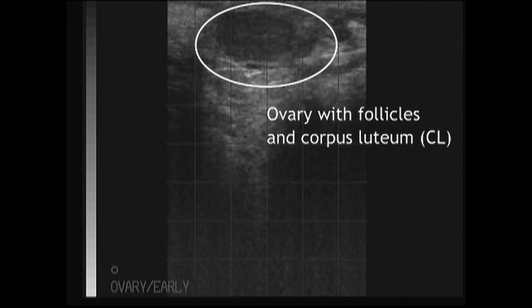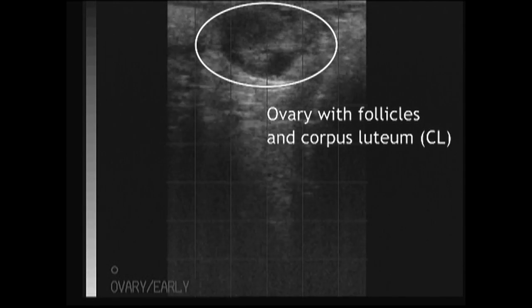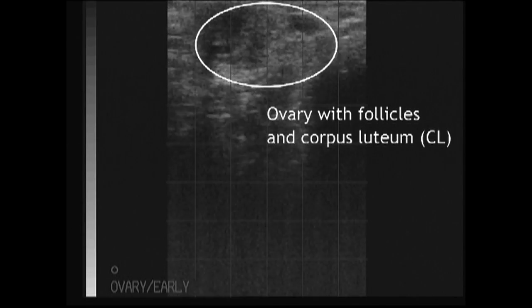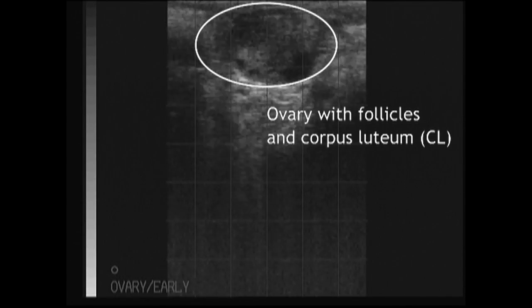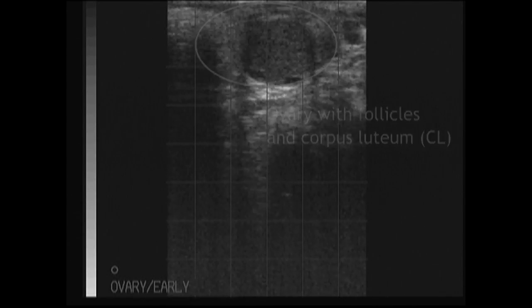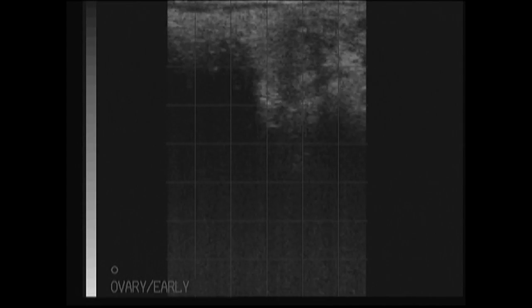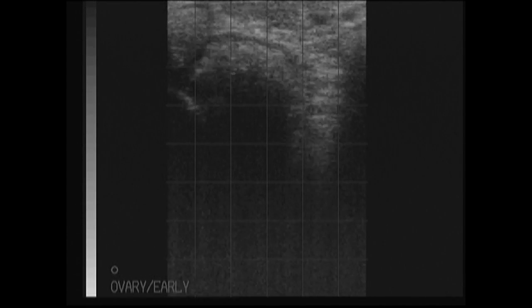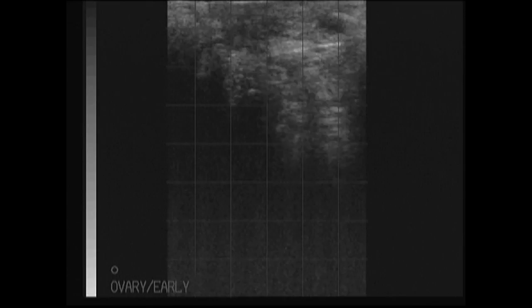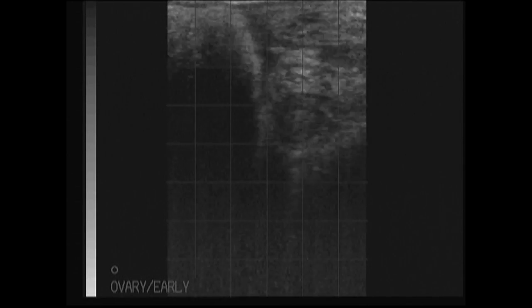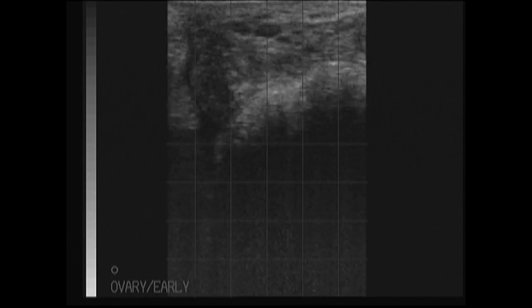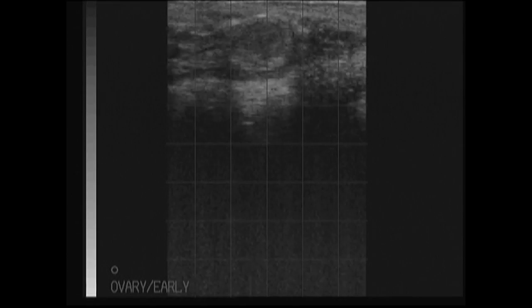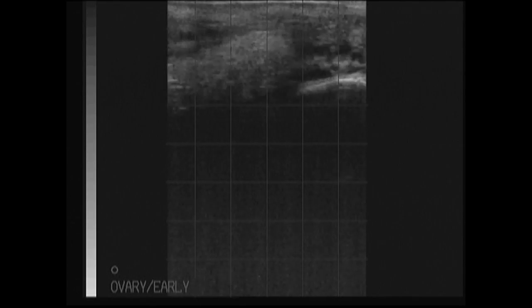We now see the ovary on this side with the presence of follicles — these dark anechoic fluid-filled structures. We also have the presence of a corpus luteum. This gives us an indication that this cow is cycling, and we may choose to use this information to manage this cycle more effectively through the use of hormones such as prostaglandin or its analogues.